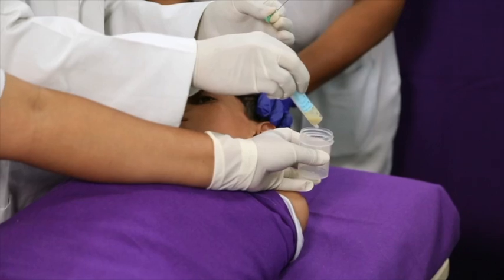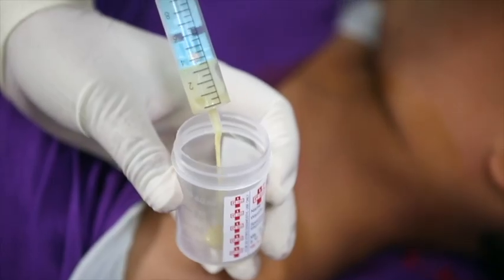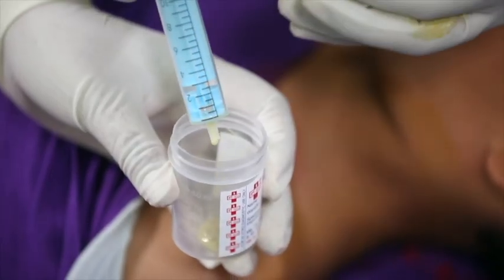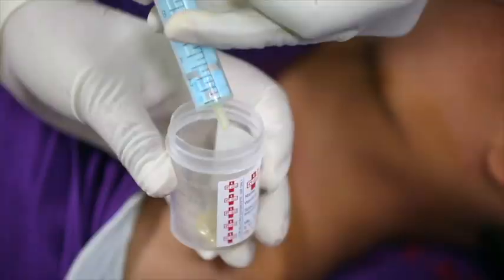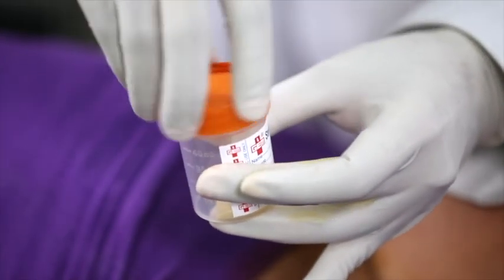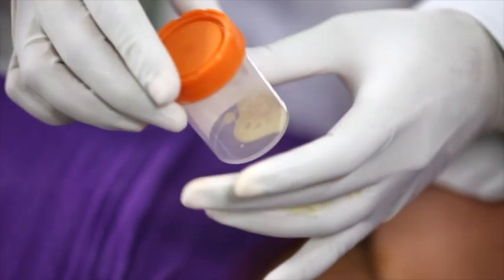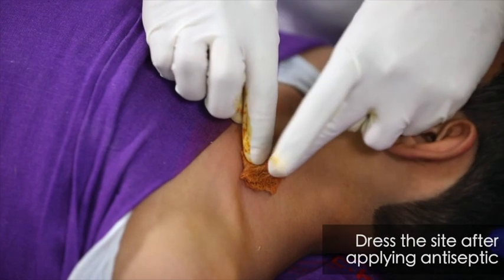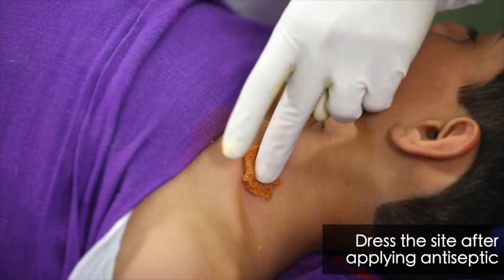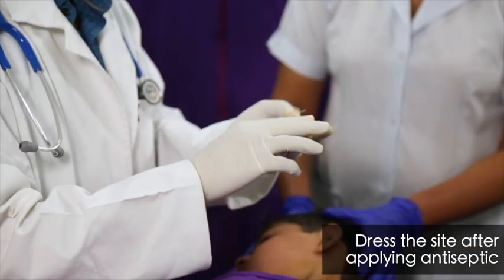Aspirate may be taken from multiple swellings and pooled before sending to the laboratory for bacteriological confirmation. At the end of the procedure, dress the site after applying antiseptic.